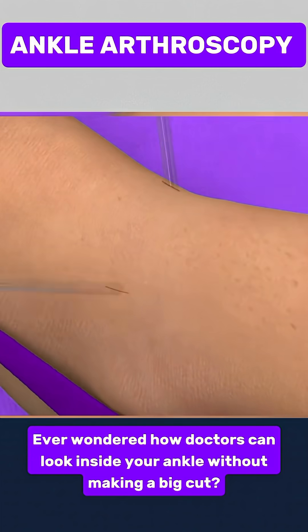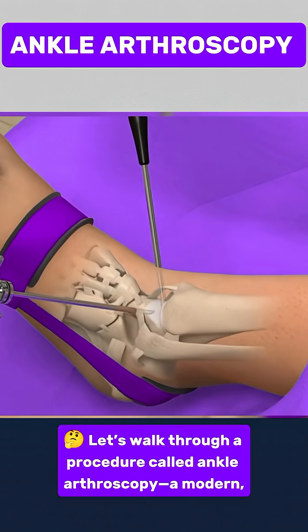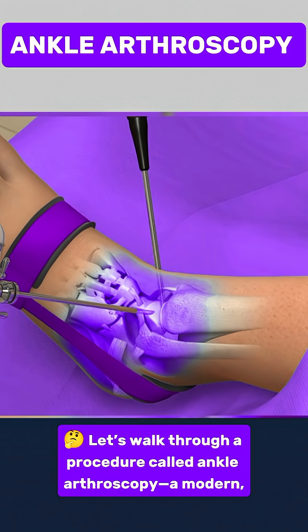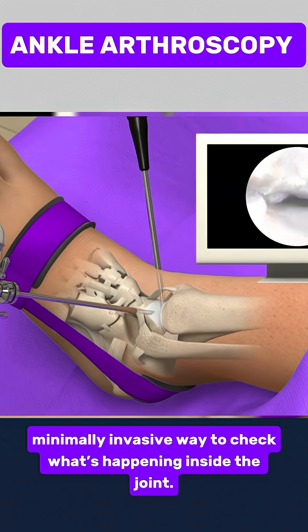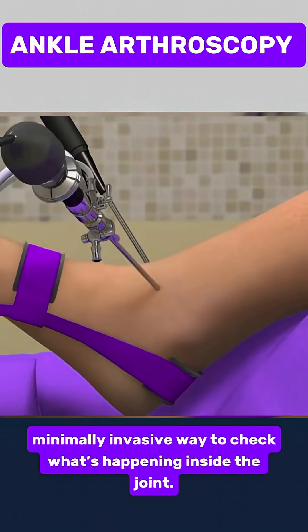Ever wondered how doctors can look inside your ankle without making a big cut? Let's walk through a procedure called ankle arthroscopy, a modern, minimally invasive way to check what's happening inside the joint.